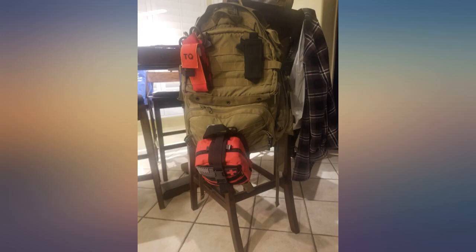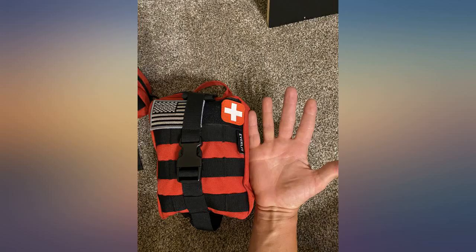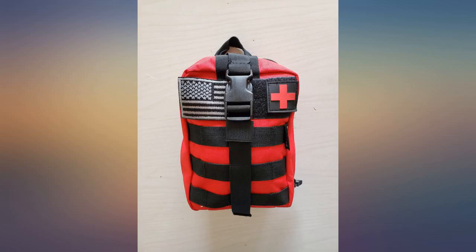Buy it. A great deal. A great small business that is veteran-owned. I used a 20-ounce Gatorade bottle as a reference — it's basically the size of 2 of those bottles but weighs less than 1. Open it up and find everything to administer first aid for a scrape, burn, cut, and much more.